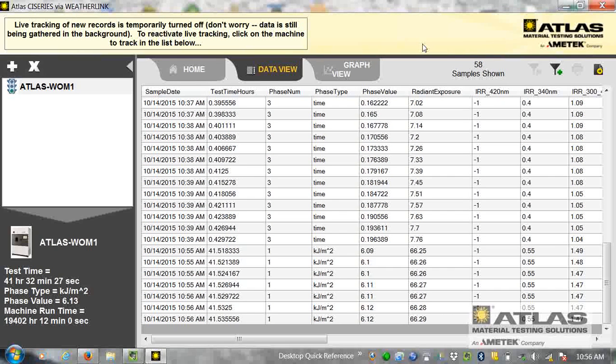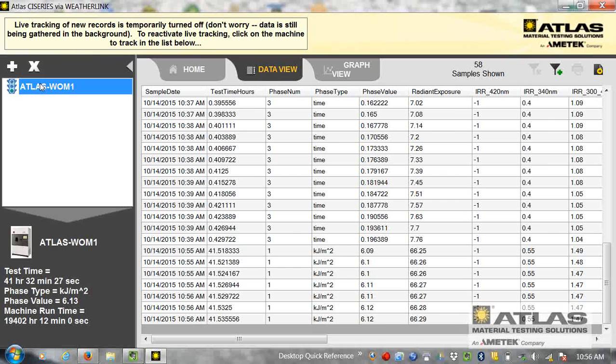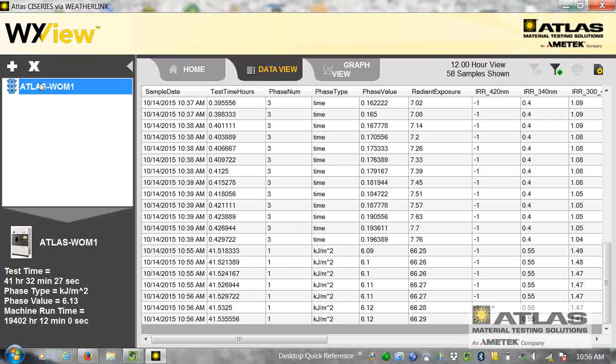So you can see there's not a lot to it as long as the machine is connected to the network, and your computer is connected to the network, and there's no firewalls in the way or anything like that.